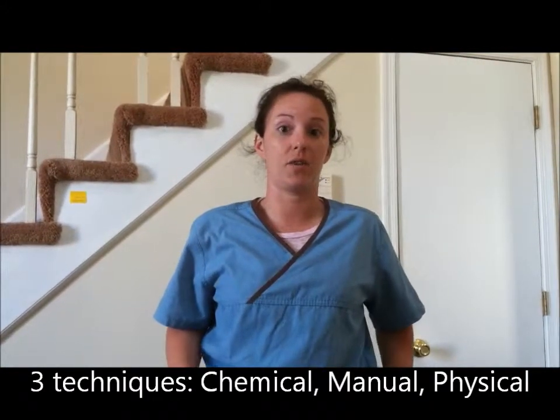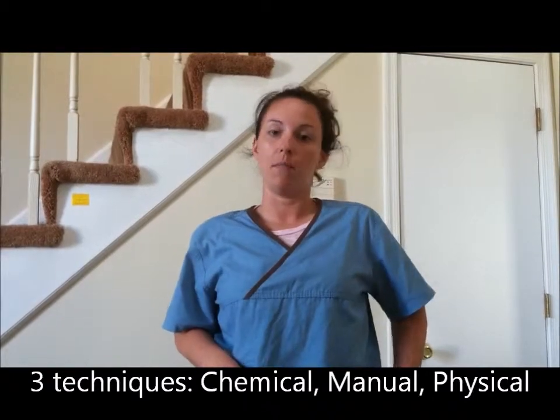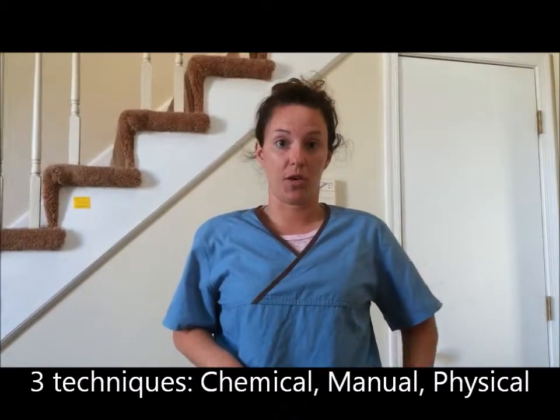So you use a cassette and place the patient on top of plexiglass or something like that on top of the cassette. However, our clinic, like I said, is digital, so we do not have the option of using a cassette. So it's already set to tabletop method when we put the avian species in. There are three separate types of techniques used for avian species in order to take x-rays: chemical, manual, and physical restraint.